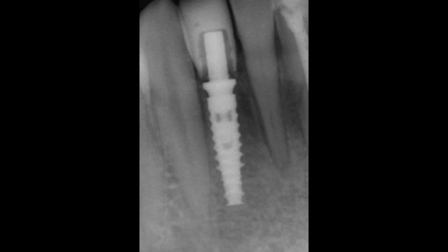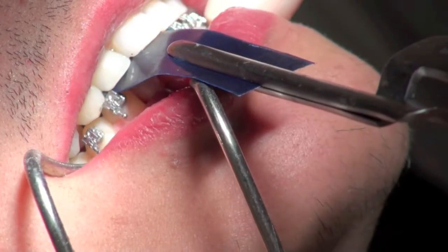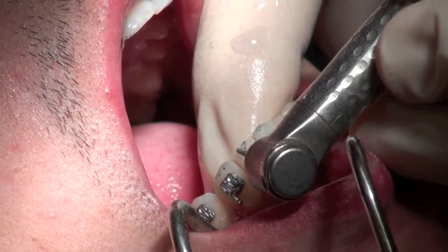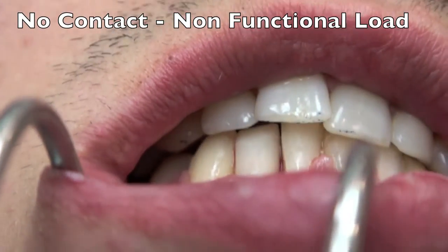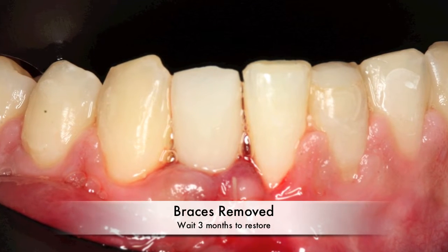We take an x-ray making sure that everything is good and everything is seated. Then we do some non-functional loading tests: protrusive, working, and non-working. On the protrusive we have to reduce this because I don't want any contact on this non-functional loaded tooth. So working, non-working, and protrusive are all cleared — the only way this is going to get hit is with a bolus of food.